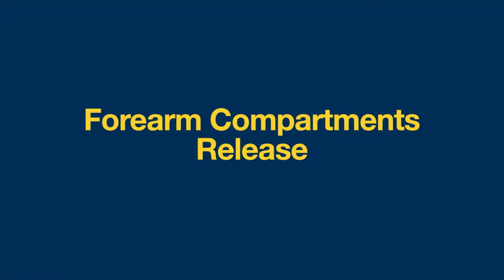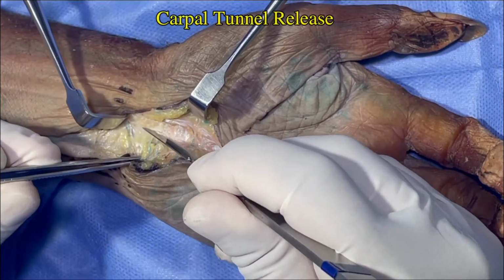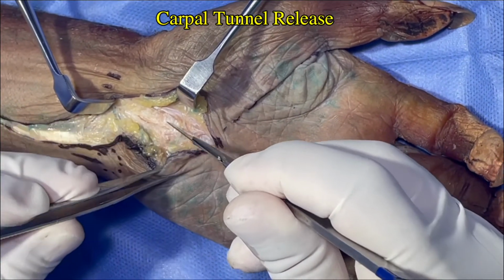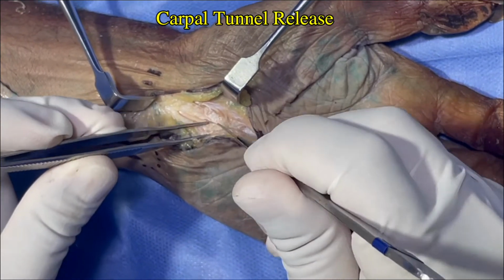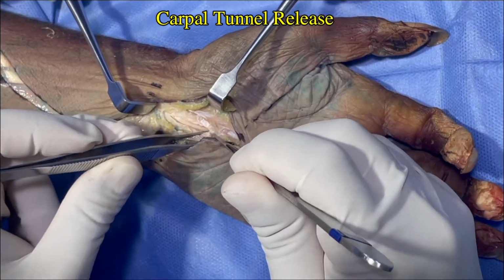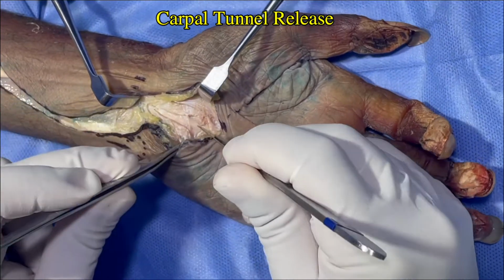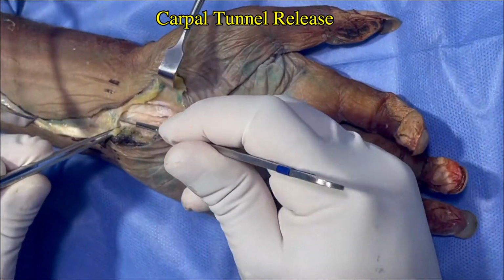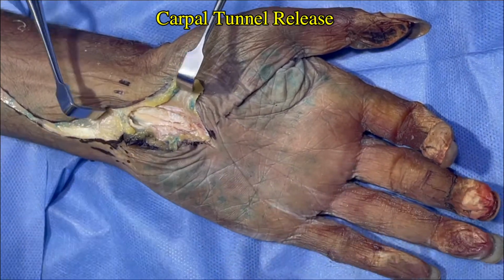Forearm compartments release. Starting from distal to proximal with the release of the carpal tunnel, longitudinally affecting the superficial palmar fascia and posteriorly the transverse carpal ligament. Here we can visualize the carpal tunnel released and the median nerve inside.